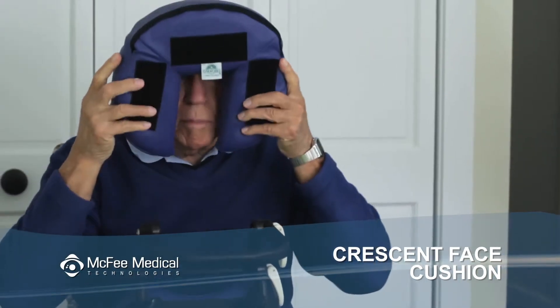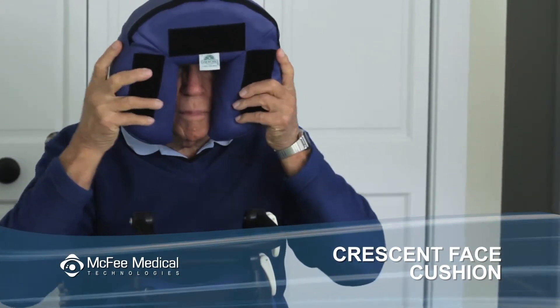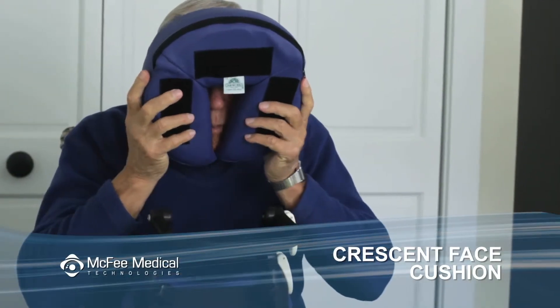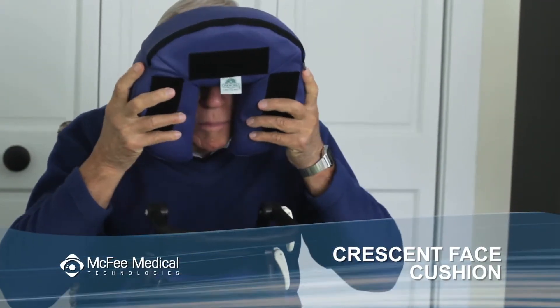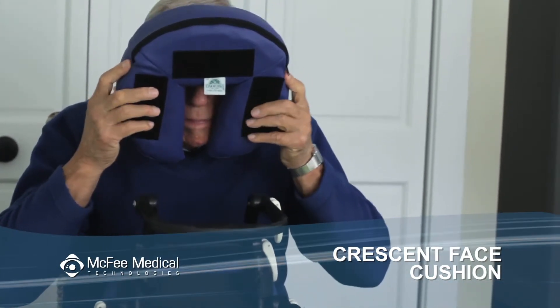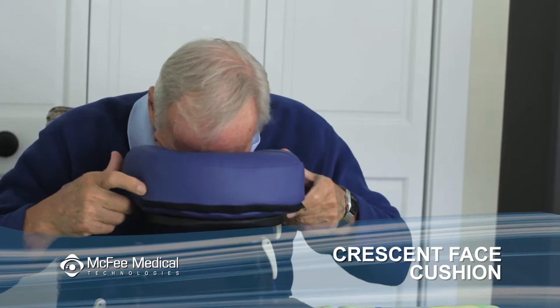Hold it up to your face in such a way that the top of the crescent covers your forehead but not your eyes, and the two points of the bottom cradle your chin. The open end of the crescent can be moved close together for smaller faces or further apart for larger ones. Now lean over the platform and settle the crescent pad in place.